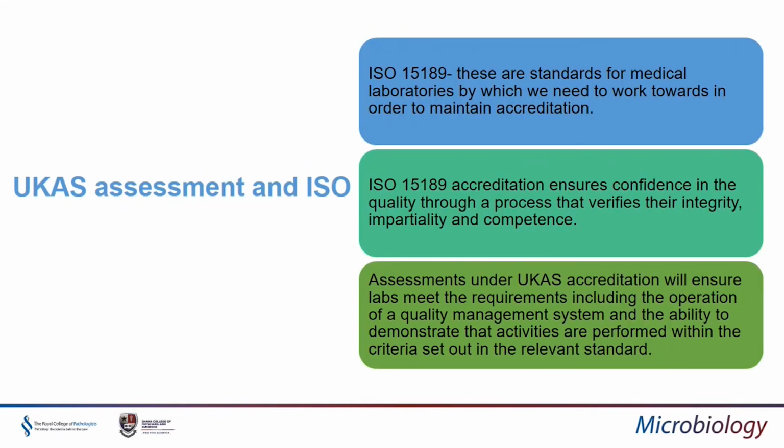UKAS assessment and ISO. So ISO 15189, these are the international standards for medical laboratories. So we all need to work towards these standards in order to maintain our accreditation. And ISO 15189 accreditation ensures confidence in the quality through a process that verifies the integrity, the impartiality, and the competence of staff undertaking the testing.